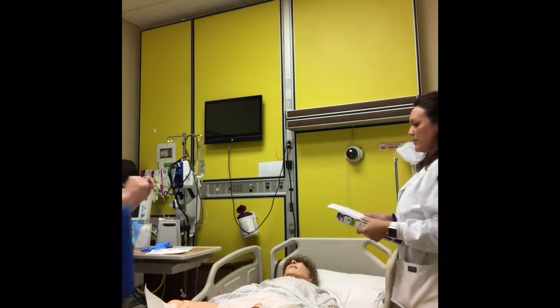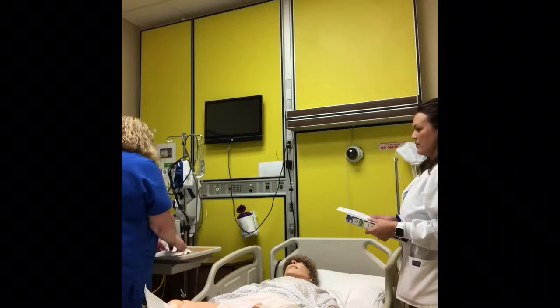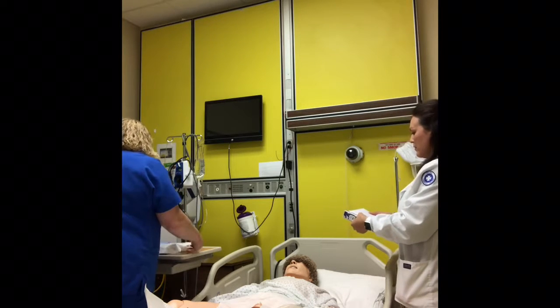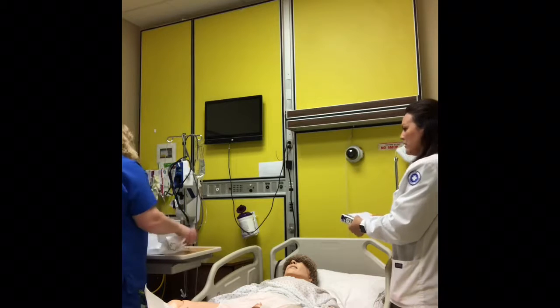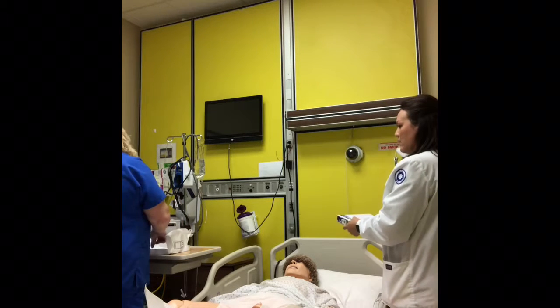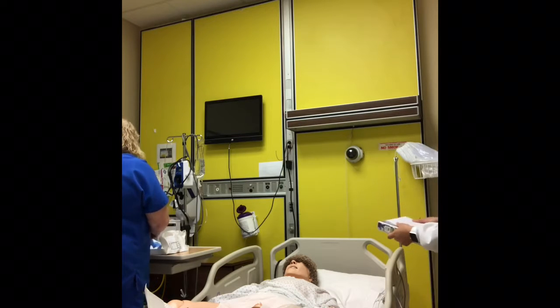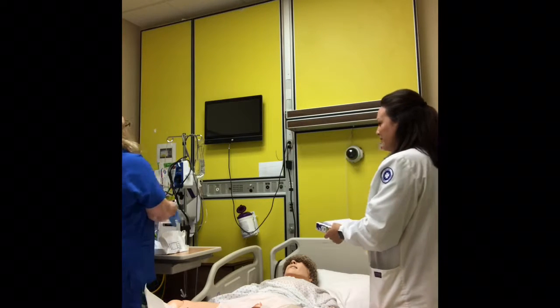So now, we're going to go ahead and don our sterile gloves. Right. There you go. That's the left. Yeah, I do left first. Oh, you do? Okay. This is never pretty.